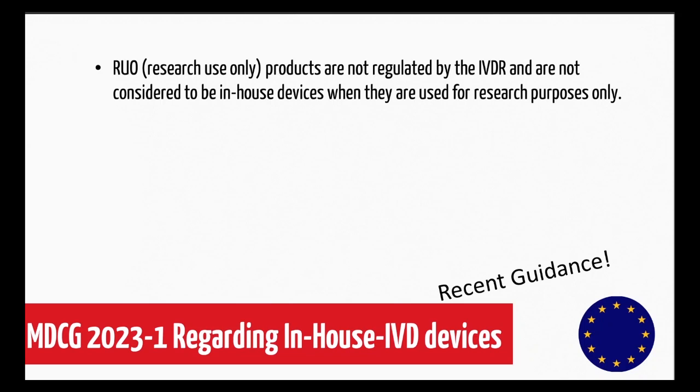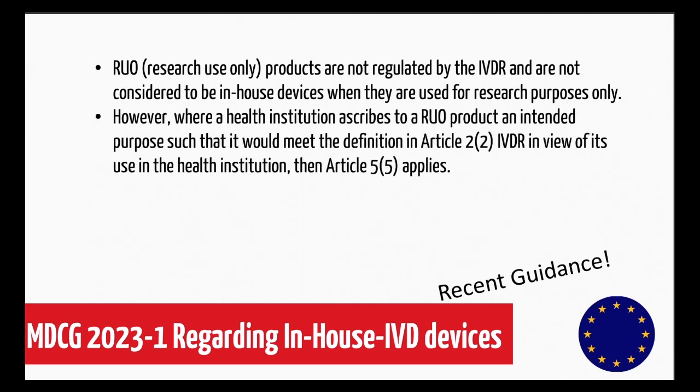We have a very recent Medical Device Coordination Group guidance in place in Europe from January this year. There it is stated that research use only products are not regulated by the IVDR and are not considered to be in-house devices when they are used for research purposes only. So if you do research, there are no limits.